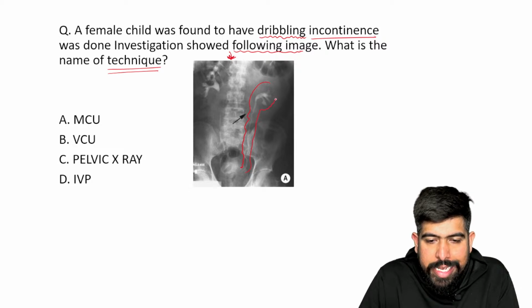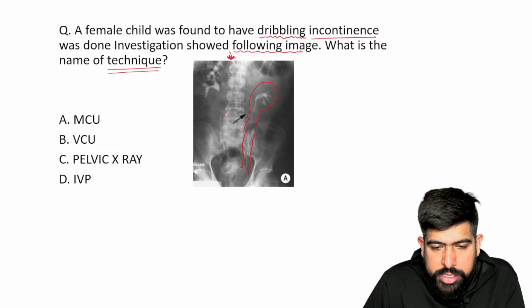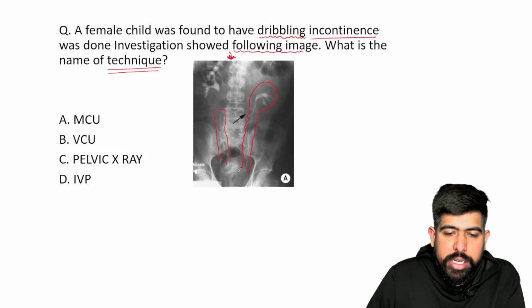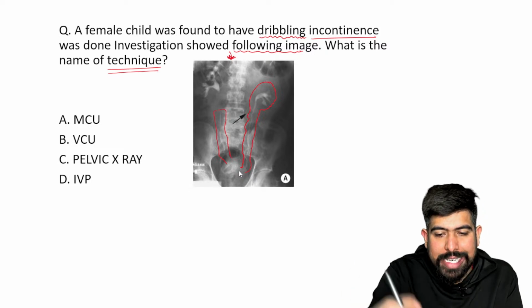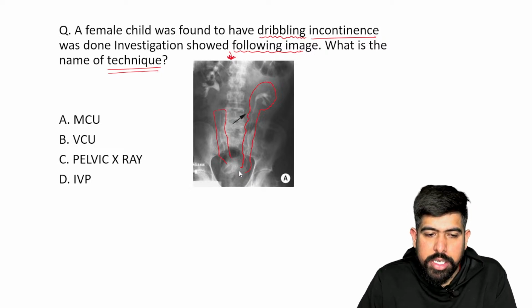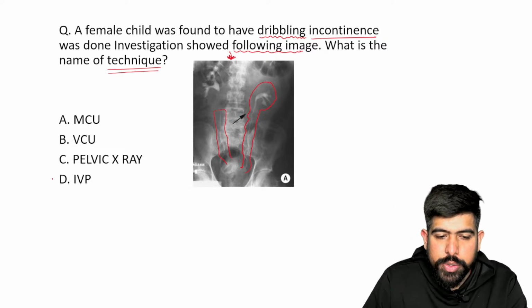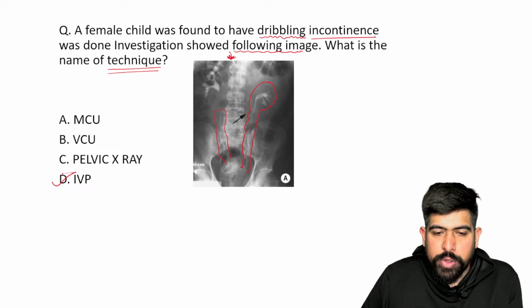So some dye is used on the X-ray, and you can see it over there. This ureter is also visible to you, and this dye will now be deposited in the bladder, and then we can take more X-rays also. So this is from your kidney area. What does that mean? This is not from the MCU. This is not the pelvic X-ray. So what is this? It is clearly seen that this is your intravenous pyelogram.